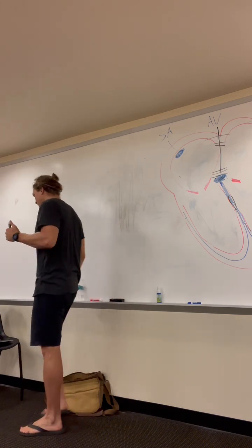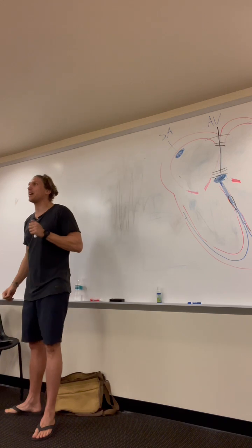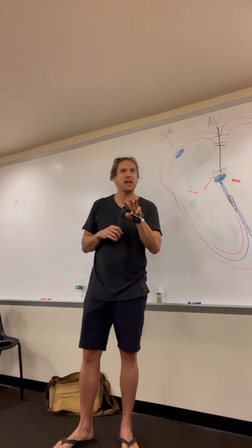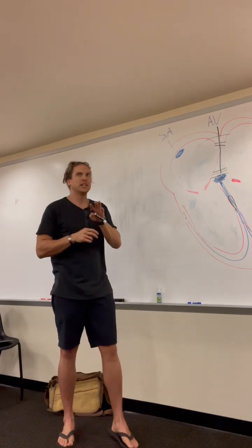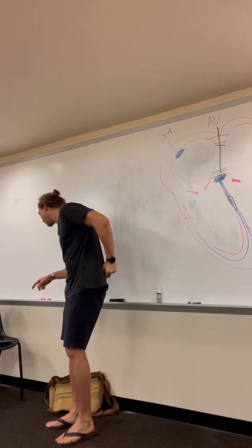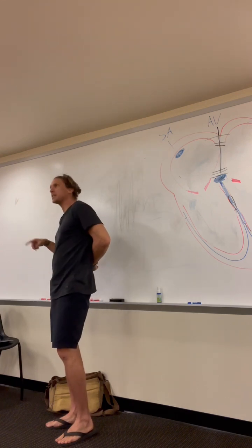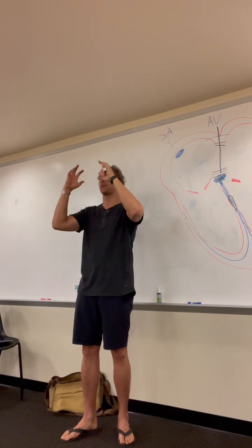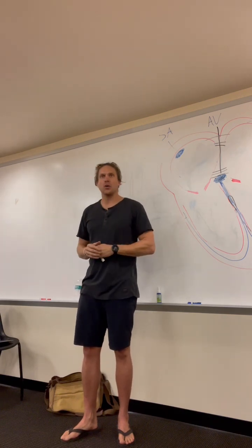All right, everyone good? One thing that can help you identify this from a-fib is if you look at these 3 P waves, they all look the same as the next 3 P waves, and then the next 3 P waves. One's kind of pointy and tilts to the left, the next one's more rounded, the 3rd one goes right up to the QRS, and then the QRS happens, and then they repeat, okay? So that's your hint. It's not a-fib. There's not a bunch of different foci doing it. It's just a re-entry circuit, is what it's called.